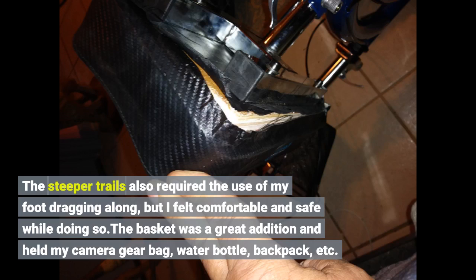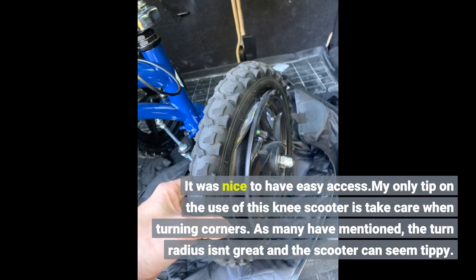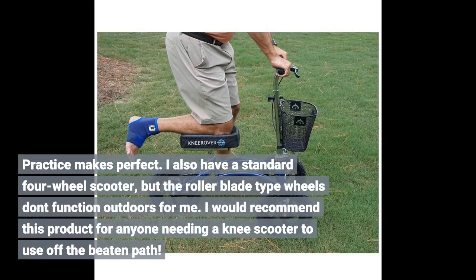The basket was a great addition and held my camera gear bag, water bottle, backpack, etc. — it was nice to have easy access. My only tip is to take care when turning corners. As many have mentioned, the turn radius isn't great and the scooter can seem tippy — practice makes perfect. I also have a standard four-wheel scooter, but the rollerblade-type wheels don't function outdoors for me.